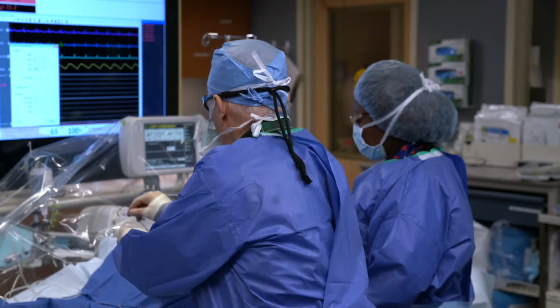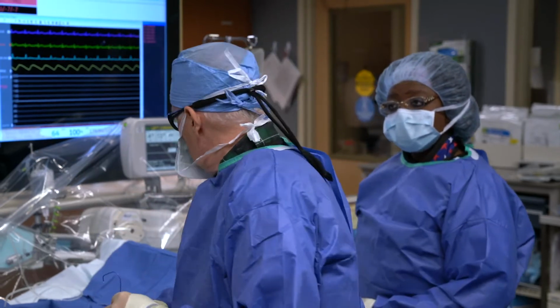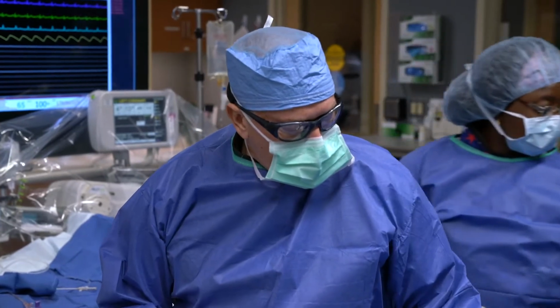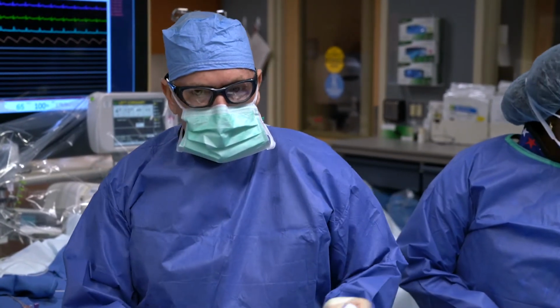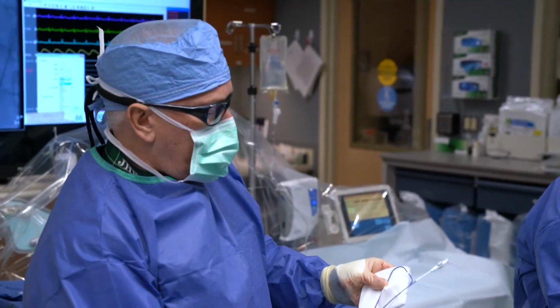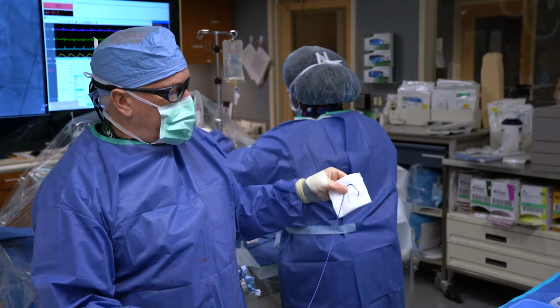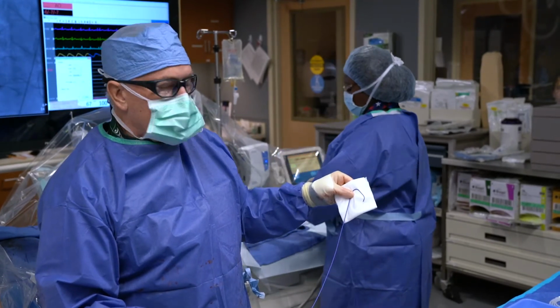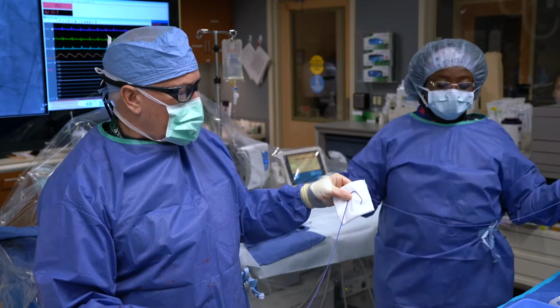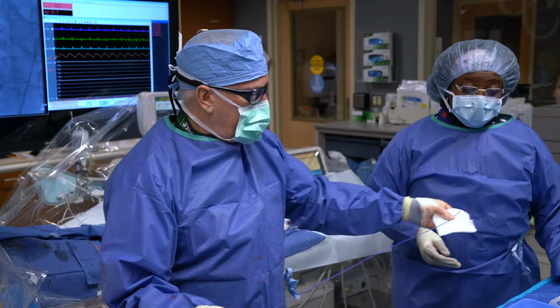The catheters that we use to take the images are preformed catheters that have been specifically made to allow us to pass the catheter through the aorta near the heart, and then are preformed to access either the left coronary arteries or the right coronary arteries, making the procedure quicker and safer.